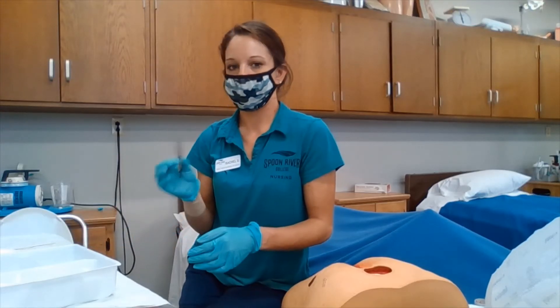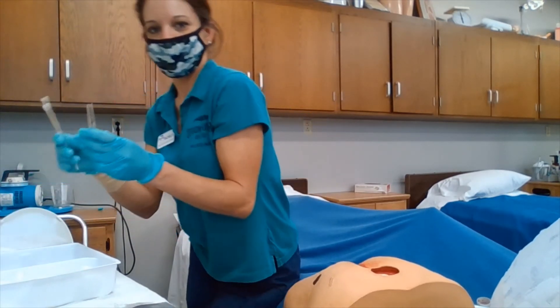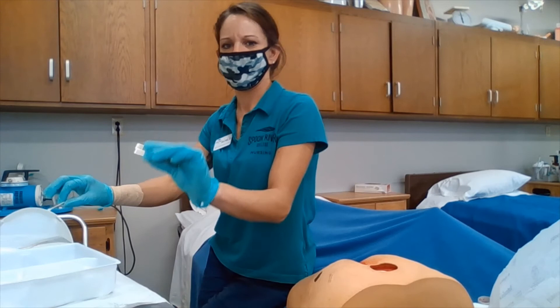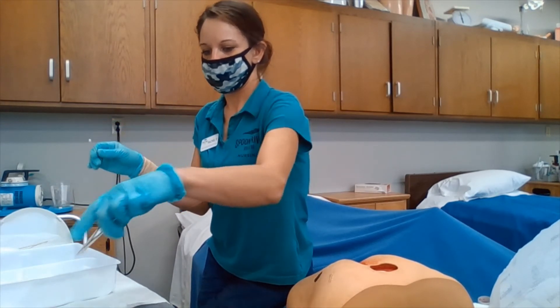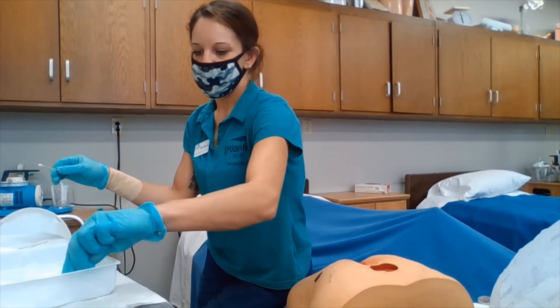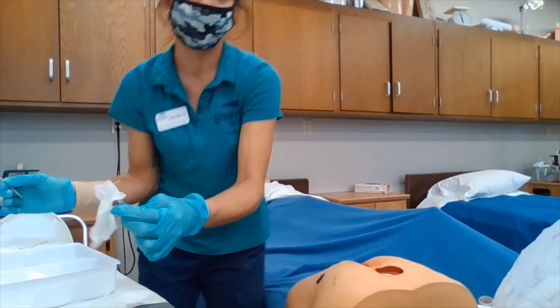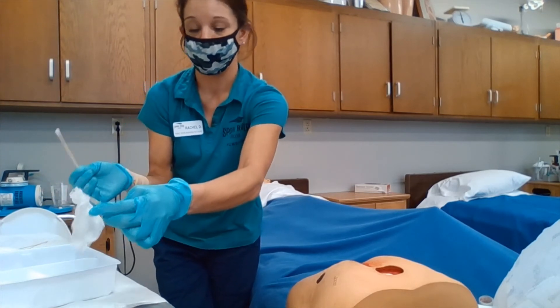We are going to be using the forceps with our non-dominant hand and the q-tips with our dominant hand. We are going to squeeze any excess solution out of our gauze pads. Then in applying the gauze pads to the wound, we are going to make sure we are doing it a layer at a time.